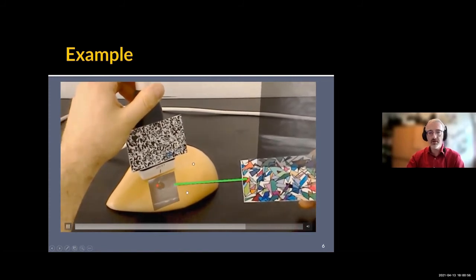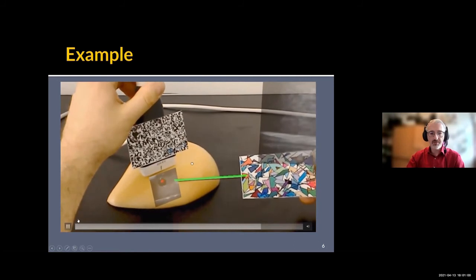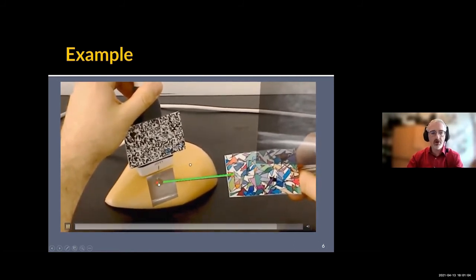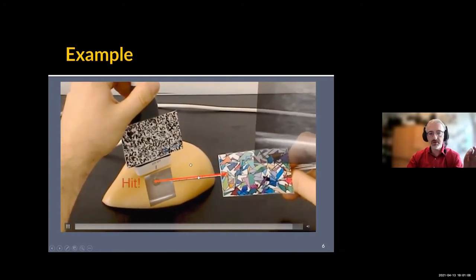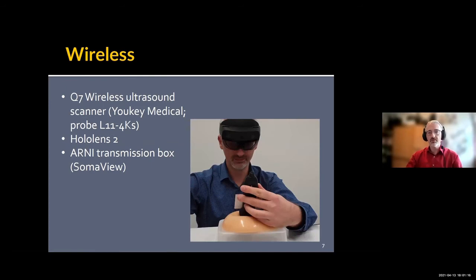We have to do further studies about accuracy of the system, but from now on, you don't have to switch between in-plane or out-of-plane or whatever you prefer—just aim at the mass you want to hit. When you hit your mass, the system turns the needle red to show you that you are in the place where you wanted to be. For that setup, we used a standard ultrasound device.